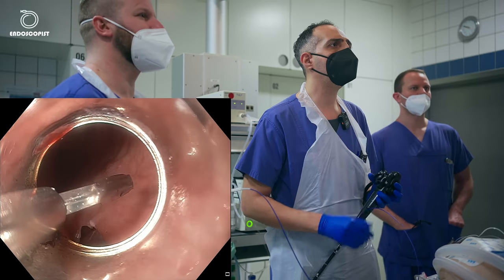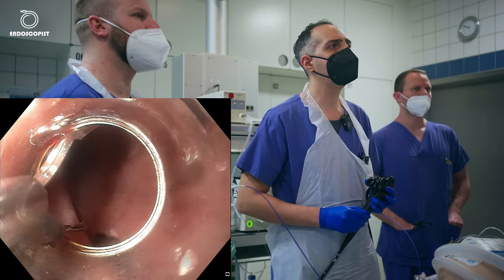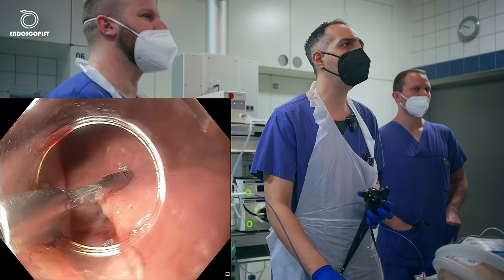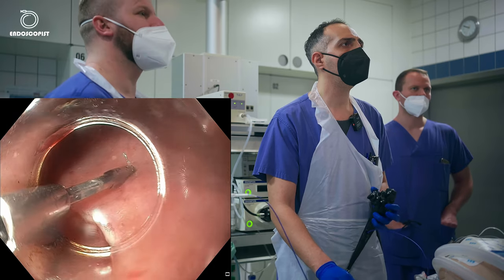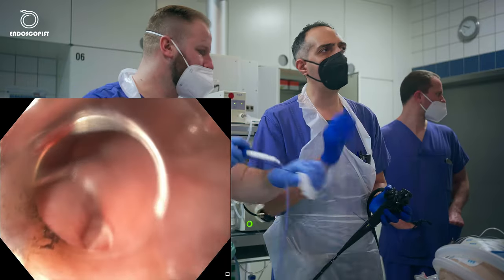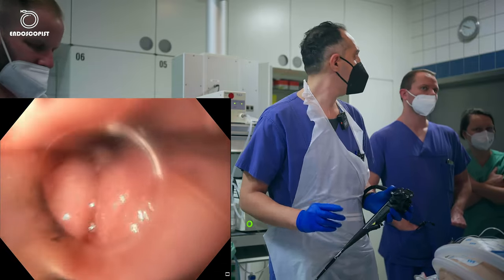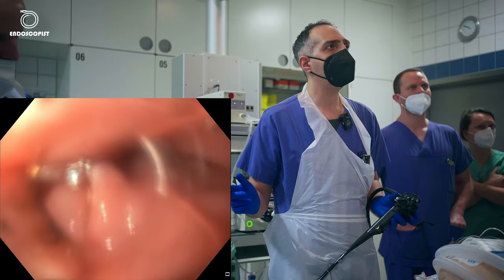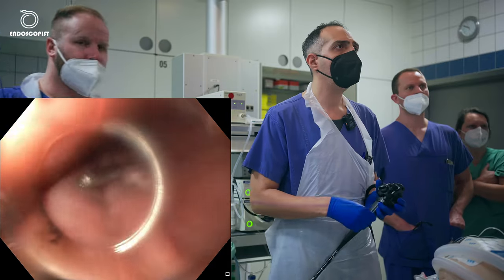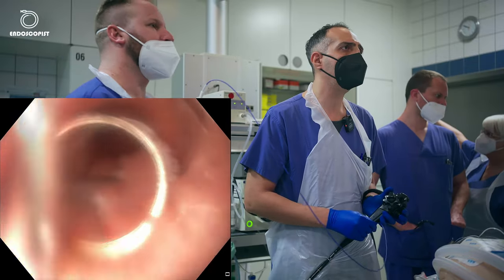Okay, I'll put it. So the first clip. I will set it here, below the lower end of the incision, so it will bring the edges together. And then I will try to close the incision. So I will need something like, I think, 4 clips or 5 clips for this area. We will see.